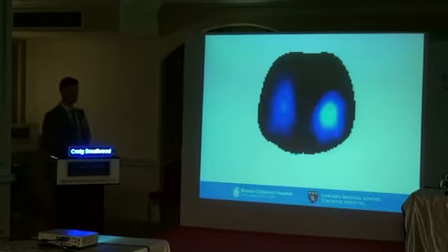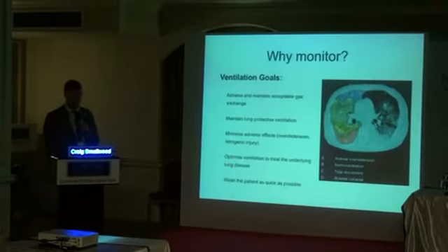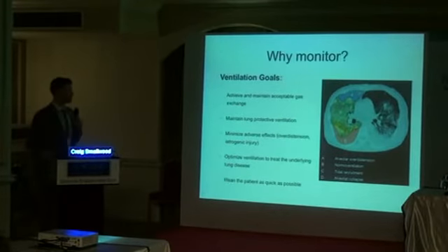If it was a nice, healthy patient, we want to see some very nice equal distribution between right and left, and also ventral and dorsal aspects of the lung. So there is some heterogeneity, and this is why we're interested in looking at these images, because our children do not have an equal distribution of ventilation. And that kind of leads us to why this matters at all.